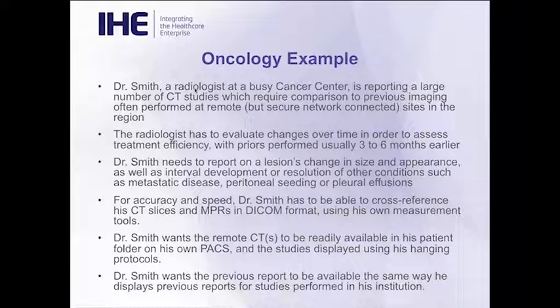And that happens again and again because the patient is usually coming back every 3 to 6 months. So I don't even talk about the speed of downloading the images when you have to look at 2,000 or 3,000 images and have to wait for the web interface to open. So it has really been identified as a priority for us if we want to be efficient, to be able to have these images displaying in our own environment the same way as if they were done on site. Have the same hanging protocol, and of course have access to the previous report.